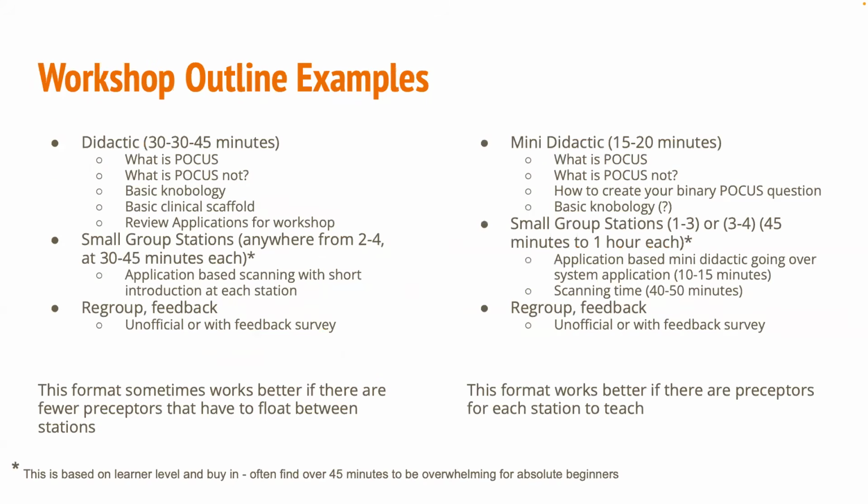So here are a couple of different outline examples. I've done both. I've done some other ones. These are some where you can think about it, but the goal here is that you don't want your didactic to really go over 45 minutes. If you think these people are super excited and they really want to know about ultrasound basics and you want to get a bunch of the application didactic knowledge out right up front, then maybe an hour, but 45 minutes is really pushing it.